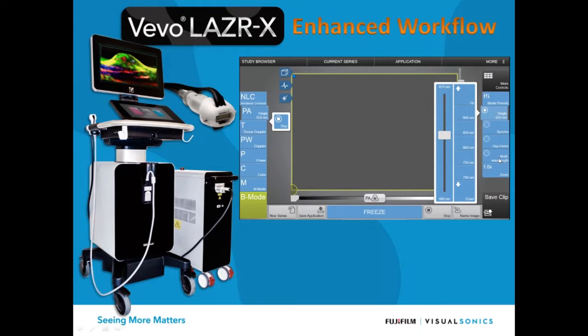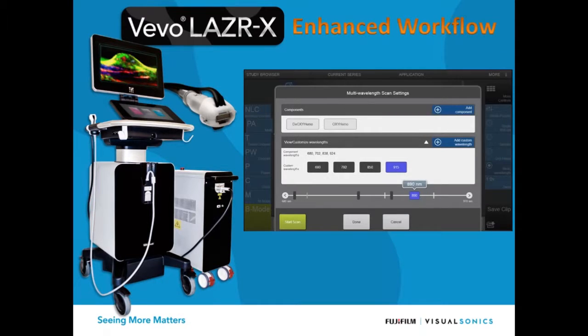And now we have PA mode on it over here, in addition to, of course, B mode, M mode, color Doppler, power Doppler, etc. And then we have all the sub-modes here. So you can image using just a single wavelength. You can image using the spectro feature to sweep across the entire wavelength range. We have the oxyhemo, where with one click you get oxygen saturation information. And the multi-wavelength imaging, which I'll talk a little bit about, for doing especially things like spectral unmixing.